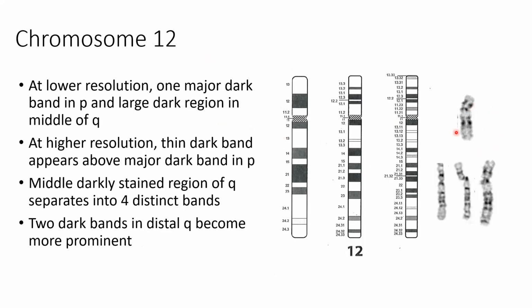And then your concentration of dark bands is higher up, closer to the centromere, and there's a lot more of the lighter staining area at the bottom, like here. And yes, remember that in any lightly staining area on a chromosome of this resolution, you get up to 650, 700, 800 bands, and you're going to see dark bands.